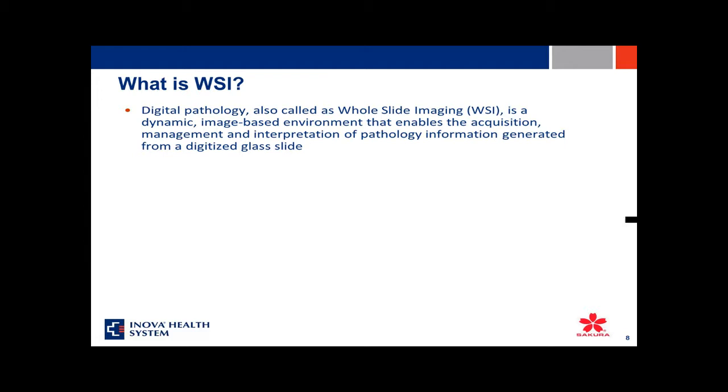I'm going to talk about whole slide imaging now. It's called digital pathology or e-pathology, precision healthcare, digital imaging. There are a number of terms to it. To keep it short, it is the technology that enables the conversion of glass slides into digital format.